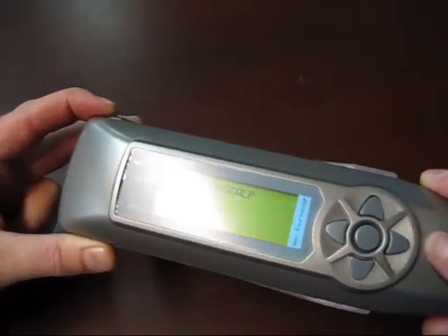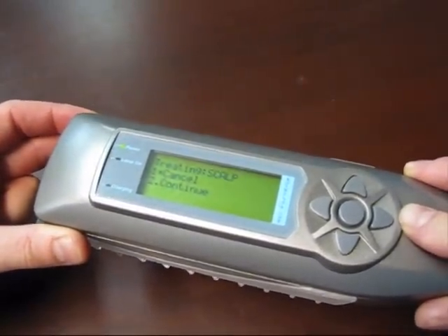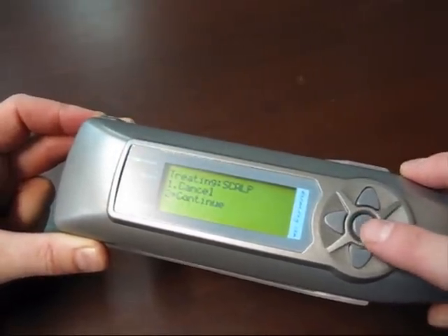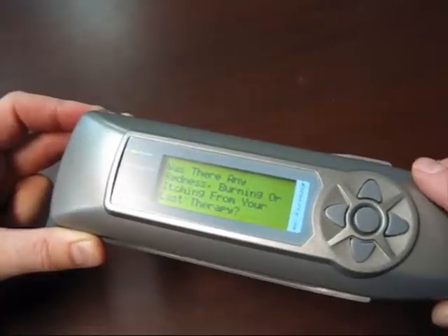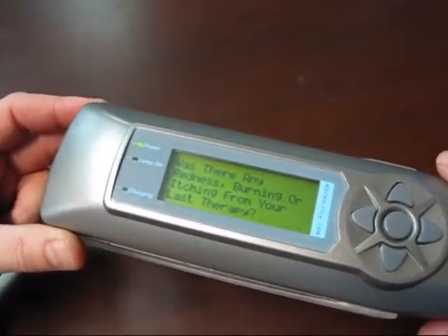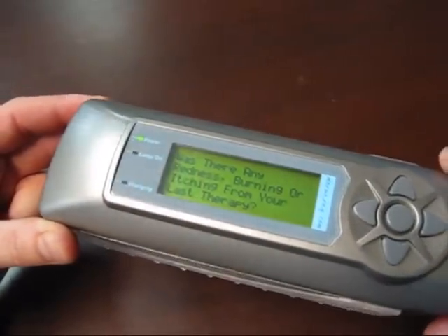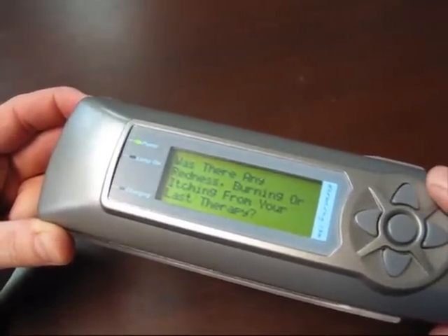But as per our recommendations, psoriasis should only be treated every 2 days at the most. So if we came back tomorrow, we wouldn't be presented with that message or the warning. So we continue. And Dermaray wants to know if, as a result of your last treatment, there was any redness, burning or itching from your last therapy? If there was, it was either too long or too strong a treatment.